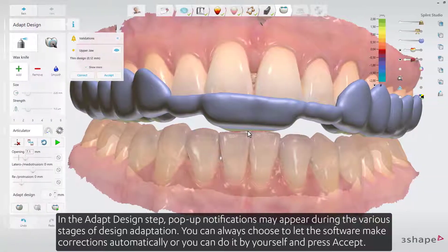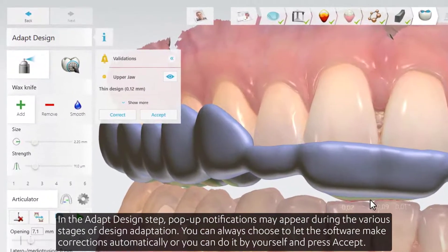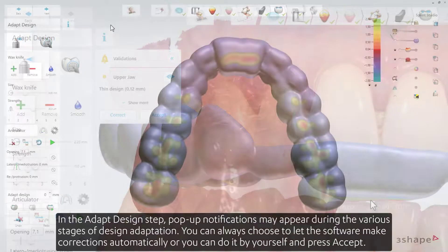In the Adapt Design step, pop-up notifications may appear during the various stages of design adaptation. You can always choose to let the software make corrections automatically, or you can do it yourself and press accept.